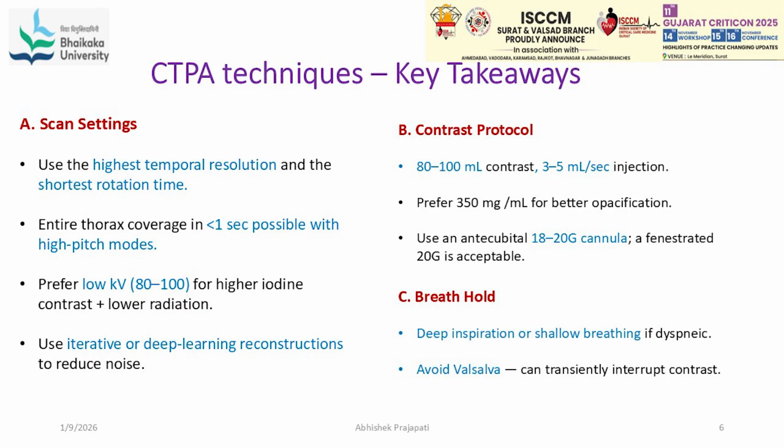Now, as it is a radiology article, there are many technical things related to radiology, like how much contrast to be given, how patients should be positioned. That technical part I have not included. The clinically relevant important information for us as clinicians, intensivists or physicians, only that I have included here. So the takeaway points are scan settings, right? So that we need to know.